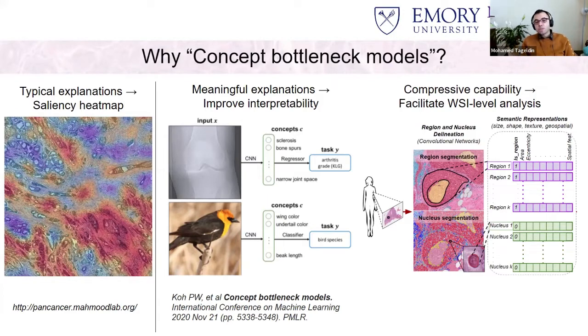So I say this is old style because the classical computational pathology workflow really was mostly about this. People would detect nuclei and detect individual chunks of cancer nests, right? And then they would calculate their individual properties, like what is their shape and texture and geospatial relationships. And then they would use this to predict various things about the patient.